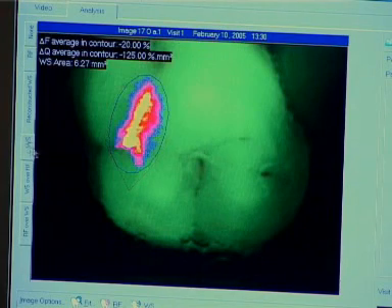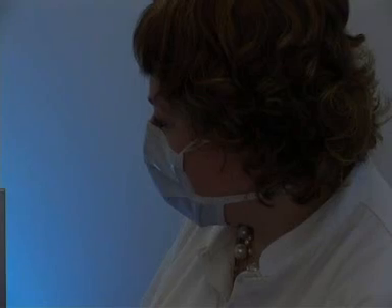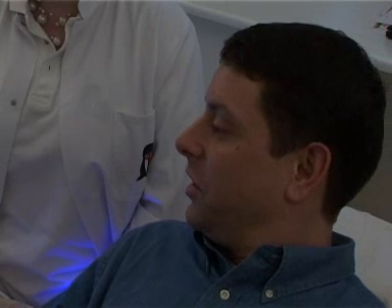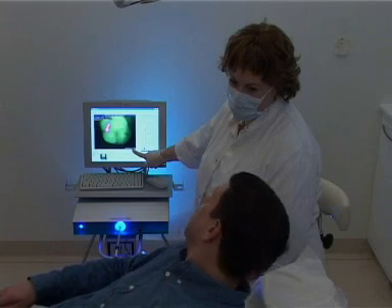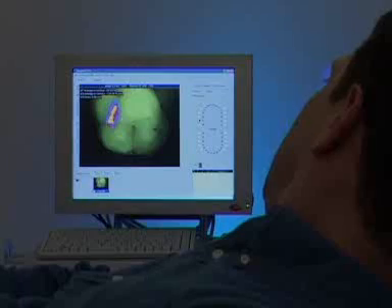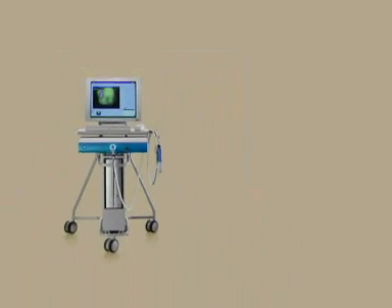Not only does the Inspector Pro provide a new and valuable insight into the condition of the oral cavity, it also creates a completely new relationship with the patient. Experience shows the Inspector Pro to be an enormously successful communication instrument that greatly enhances the patient's compliance with treatment and oral care at home. In this way, the Inspector Pro sheds a completely new light on dentistry.